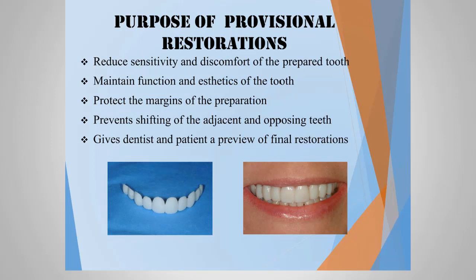And lastly, giving the dentist and the patient a preview of the final restoration. A lot of times, patients, especially if you're doing multiple teeth or anterior teeth, are really unsure about how this is going to look and feel. So we want to make temporaries that mimic and look and feel like the final restorations, to give them a sense of, okay, yeah, this is going to be okay, and we can move forward with the case.